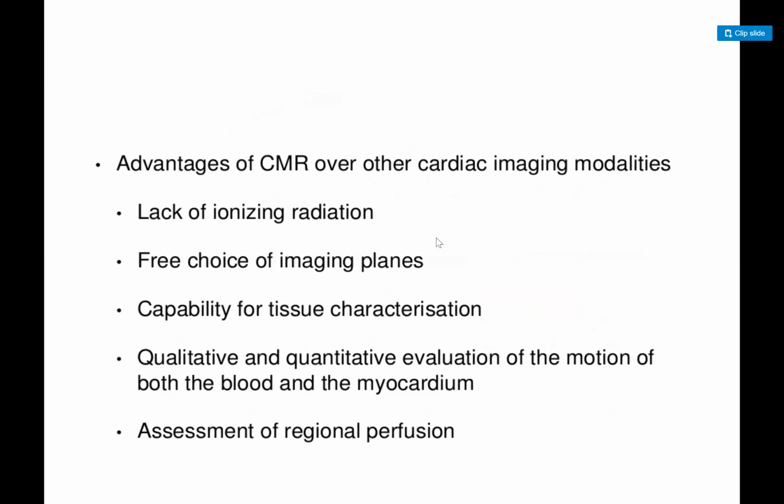So I think that's much. I can go in more detail in the physics, but I think that's good enough for you guys now. And we can always discuss afterwards in questions. So the advantages of CMR over other cardiac modalities are there's no ionizing radiation.